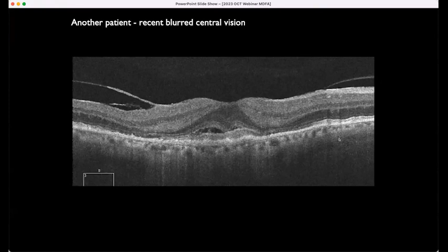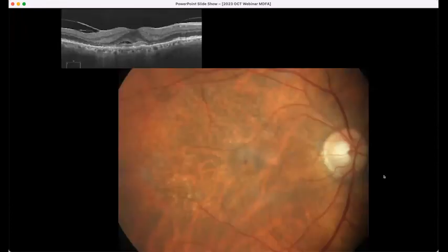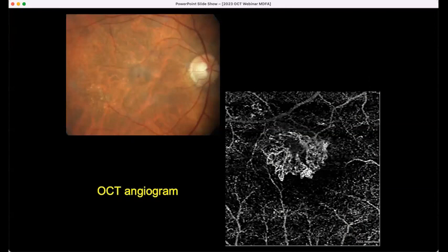This is another patient with recent blurred central vision. Even though there is very prominent and thickened posterior hyaloid, this is vitreo-macular attachment rather than vitreo-macular traction, and that's not the cause of the pathology — it's just a very broad attachment of the prominent hyaloid. The action is down here: there's a small hemorrhage, a grayish appearance, subretinal fluid, and the patient has a neovascular membrane.